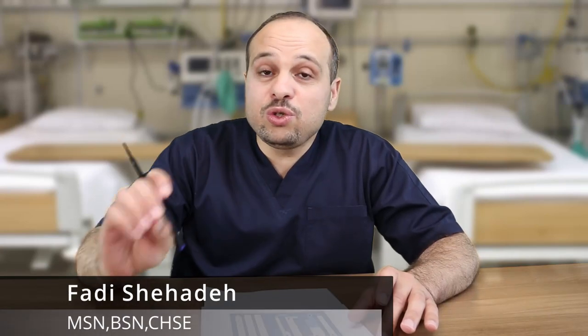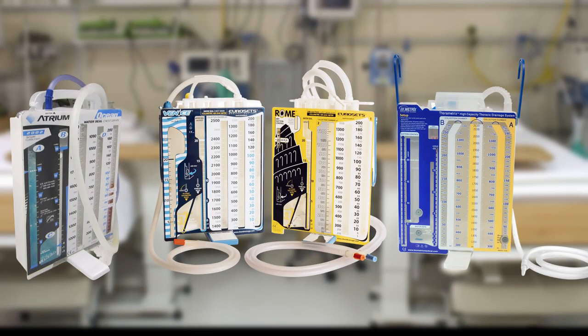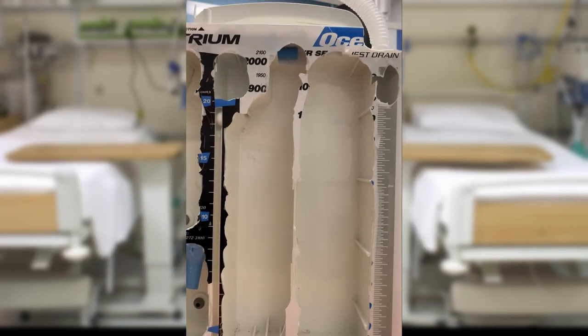The best way to deal with a chest tube is to understand the concept and how it works. In the three-bottle chest chambers, I'd like to emphasize that all of them are doing the same thing — the same principle. They have three chambers, three bottles.